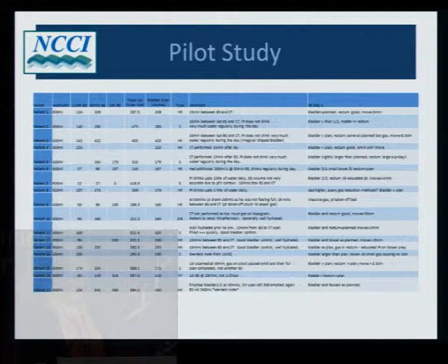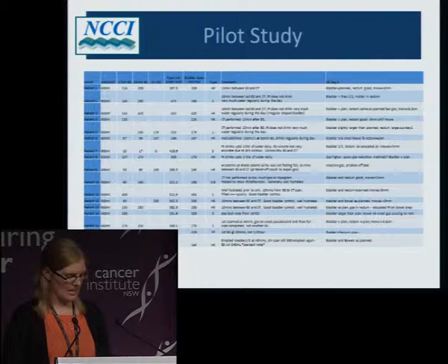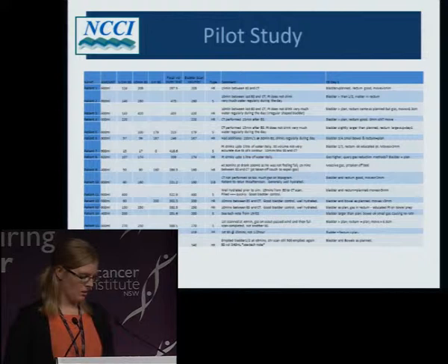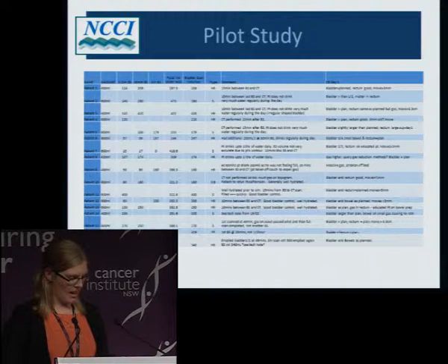Using an Excel spreadsheet, we recorded the bladder volumes at each of those time periods, the approximate time between the last bladder scan and the CT scan, the volume of the bladder outlined on our planning scans, and a comment related to how their general hydration is. We also recorded weekly CT cone beam scans that were taken on the machine, with a comment for each of those. So the aim of the pilot study was just to identify any issues with the proposed bladder scan process before we went to a larger group.